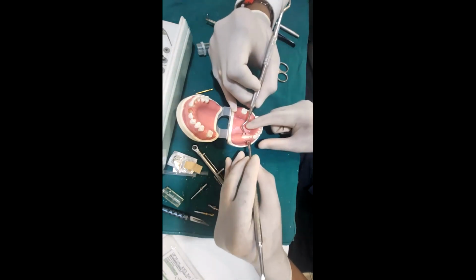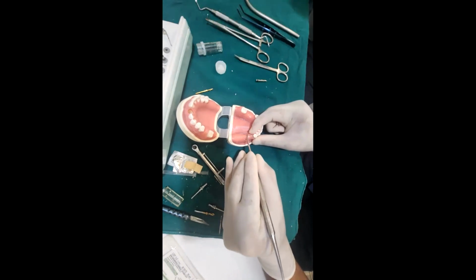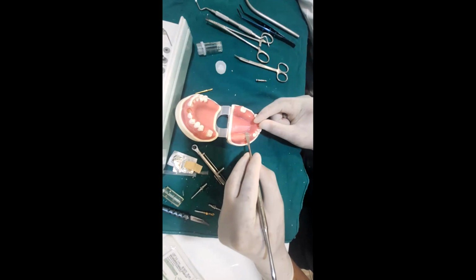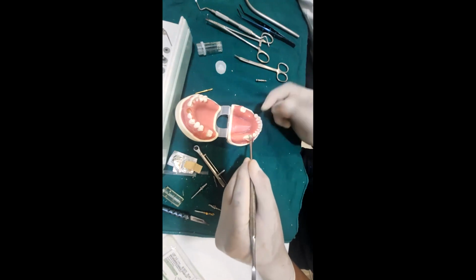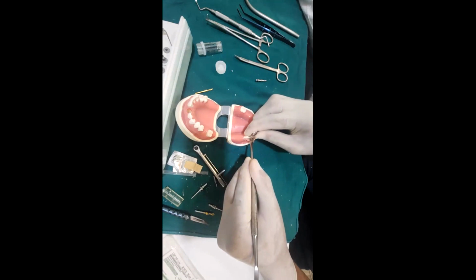This is how it is, and you will have a good soft tissue closure, a suture here and a suture here, and you are done. Now we will not do the suturing because we are going to show the second stage as well, and impression making. So I will proceed with that immediately. I hope everything is clear so far.